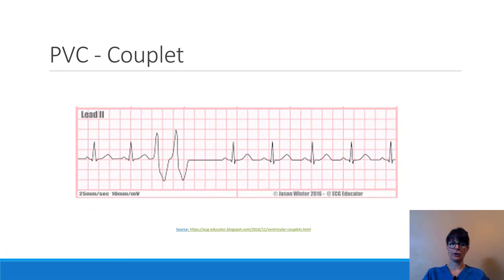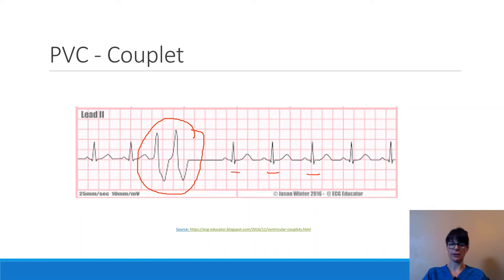Here is an example of a couplet: two PVCs in a row. They both have the same shape and occur sequentially. With an underlying sinus rhythm, this would be interpreted as a sinus rhythm with two coupled, unifocal PVCs.